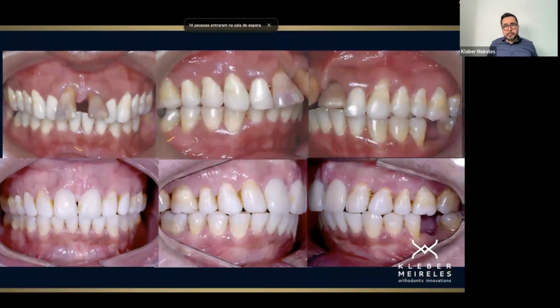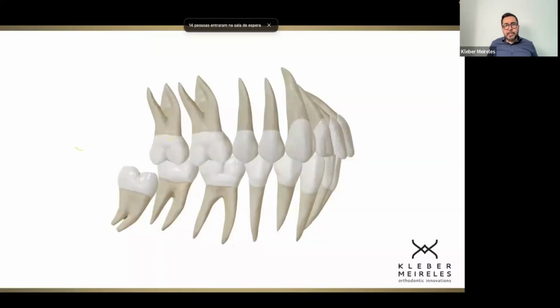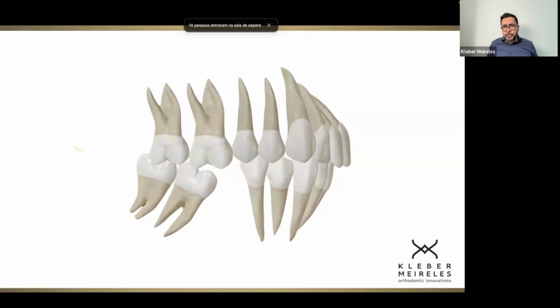So here it is, before and after. And again, still applying one line of action of the force in a very common situation. I'm just picking some situations here. I can show to you what you can do if you want to apply this. One line of action, if you want to do the translation, you need to understand at what height you're going to do this. So we're focusing now on individual movements.